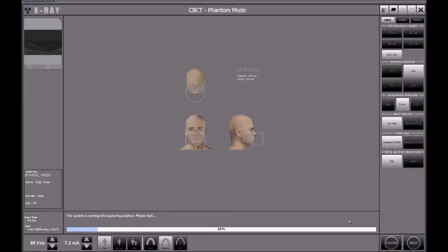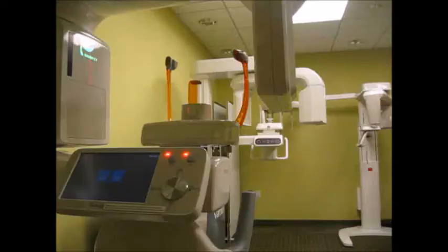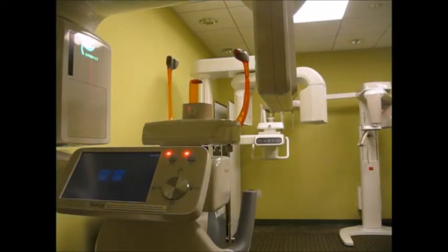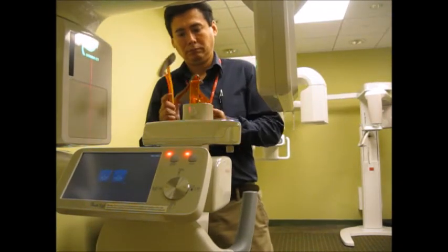Also notice that we have selected occlusal for the vertical position, and horizontal position is center in this case. After a few seconds we will see the machine moving, and that is when we will start positioning our inspection kit on the chin rest, as you will see on the screen. When you see the ready button blinking, that's when we usually position the patient.